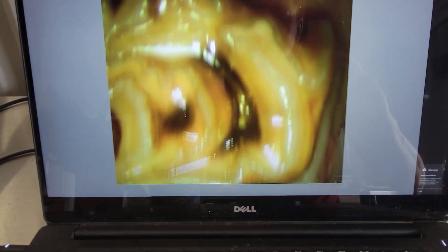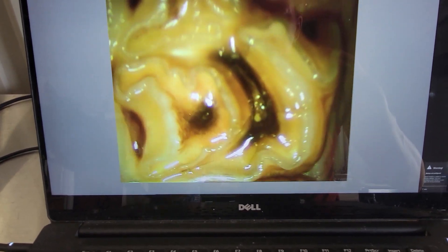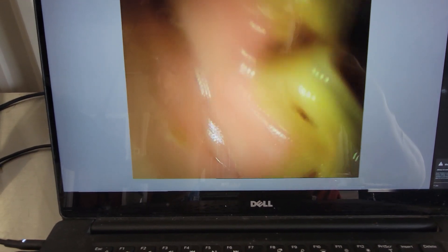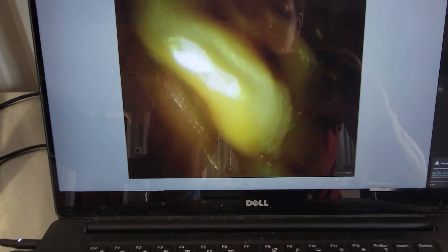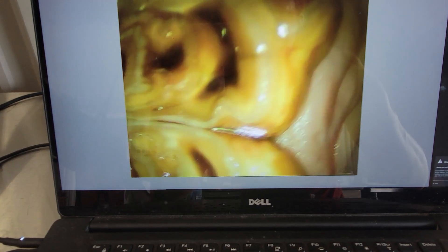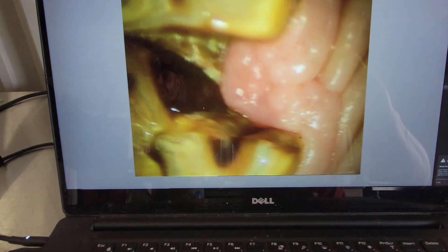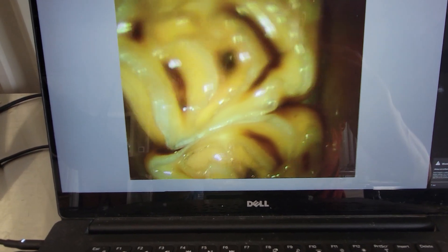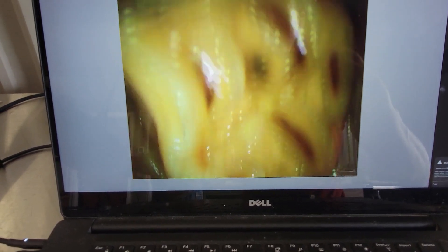We also have pulp number 4 here that's open. Pulps 1 and 2 look pretty normal. It's very important to always look at the buccal aspect and the lingual aspect of all teeth. This is what it looks like orally, and that's the reason why he was referred in here.